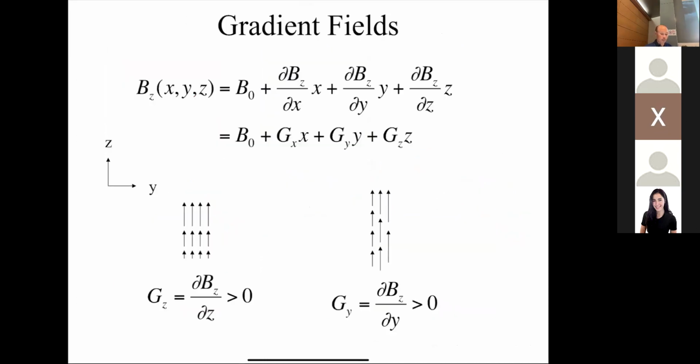Now we're going to start building up to what an MRI sequence does. A big part of what an MRI sequence does is we change the gradients in time, because we need to scan through k-space. The way we do that is by changing the gradients over time. There's an infinite number of ways you can do it, but for today we're going to pick the simplest way, which is called spin warp, which is used right now. There's probably thousands of scans being done at this moment with that spin warp sequence. For your upcoming homework, you'll look at some other trajectories, like I think a square spiral trajectory.